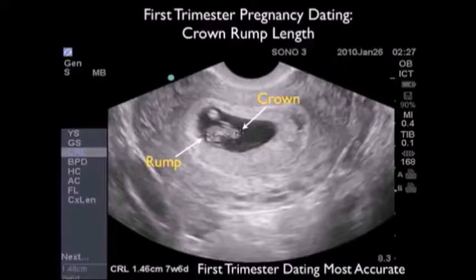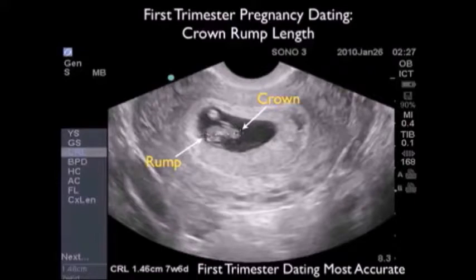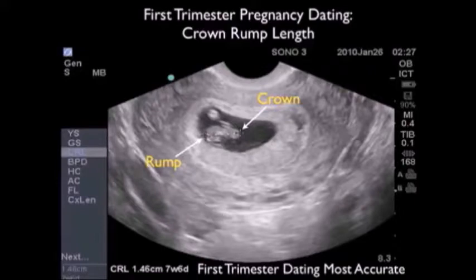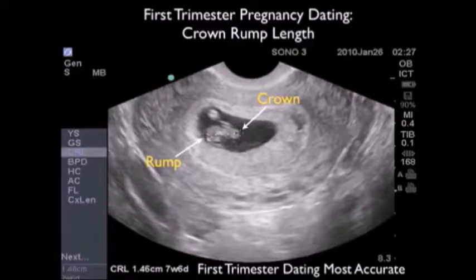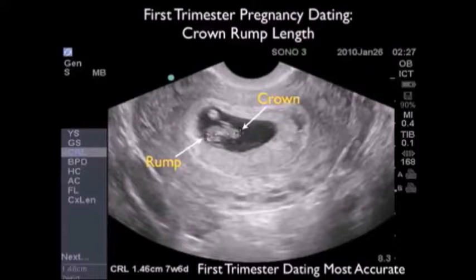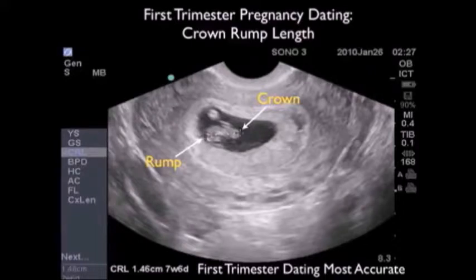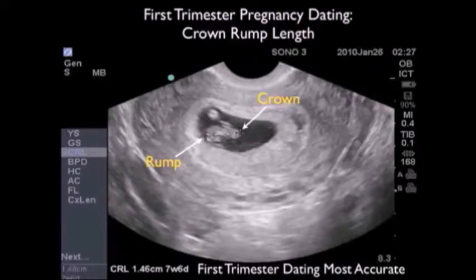As first trimester dating is considered one of the most accurate during the entire pregnancy, it's nice to print this image out and give to your patient to take for their follow-up visit with their OB-GYN.